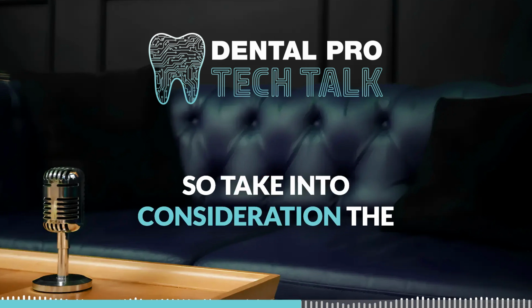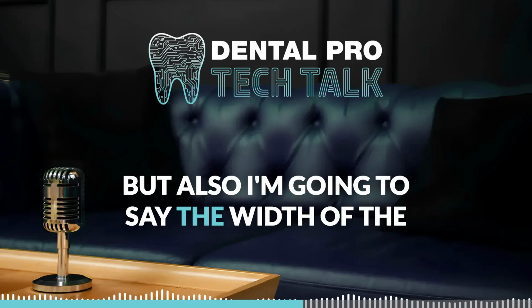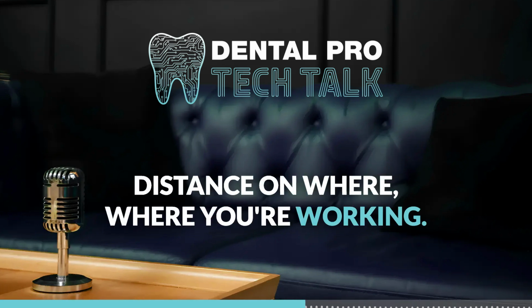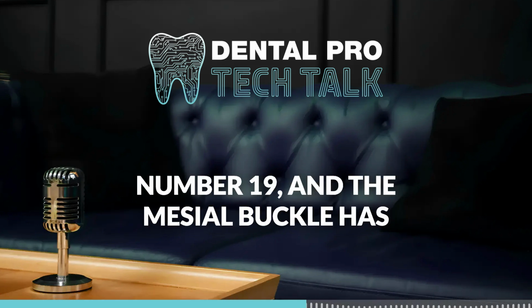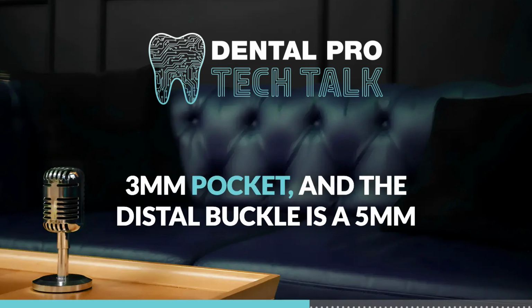So take into consideration the depth of the pocket, and not only the depth, but also the width of the pocket, because that becomes your working distance on where you're working. For instance, if I'm on the buccal of tooth number 19 and the mesial buccal has a 4 millimeter pocket, the straight buccal is a 3 millimeter pocket, and the distal buccal is a 5 millimeter pocket.